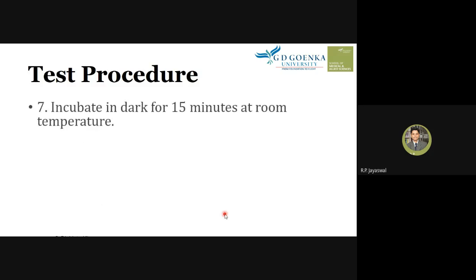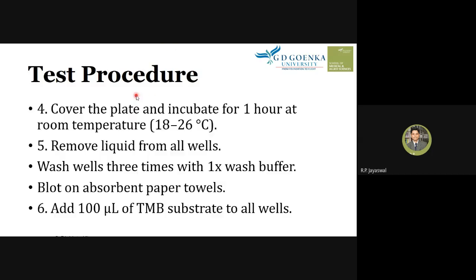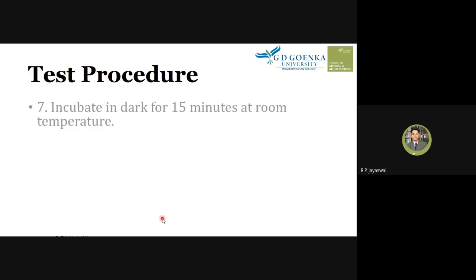And then we should incubate in the dark. This is dark incubation because TMB is light sensitive. We are adding 100 microliter of TMB. After addition of TMB, incubation is required for 15 minutes at room temperature, but it should be provided in dark condition.